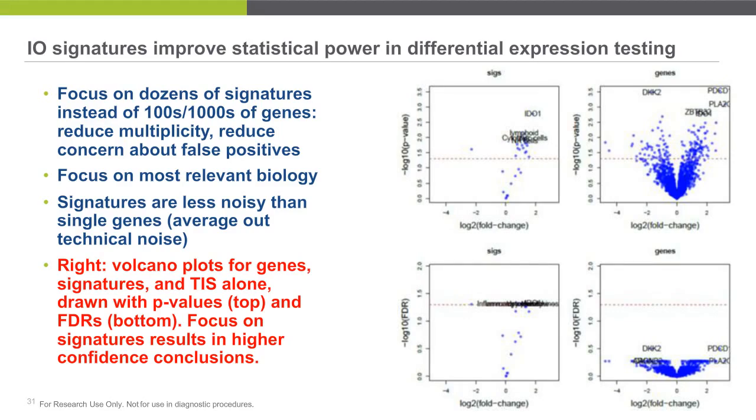And if we look at the genes, a whole ton are really significant. Some pretty tiny p-values there, some below 0.001. So there's a lot of information in both cases here. But of course, we can't just test 2,000 hypotheses and be satisfied with the p-value cutoff of 0.05. We need to do some sort of adjustment for multiplicity to make sure we're not getting excited about genes just because they were lucky instead of actually useful.